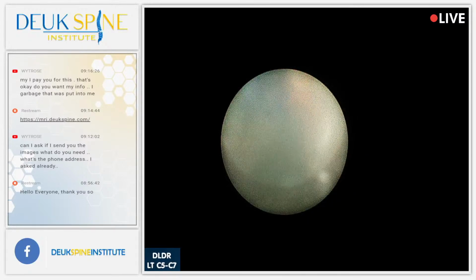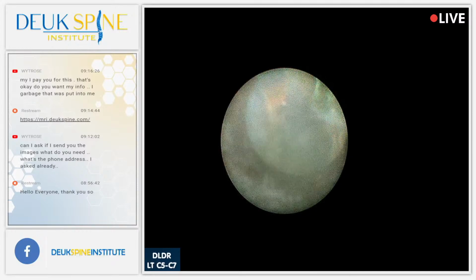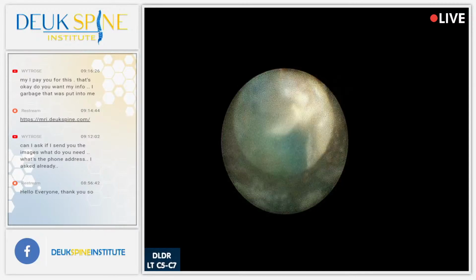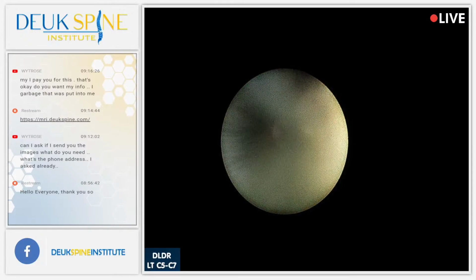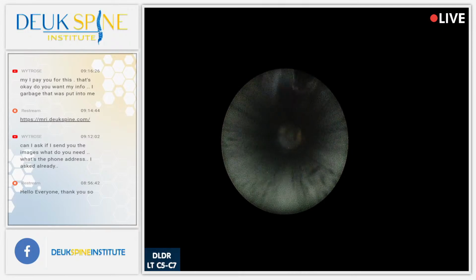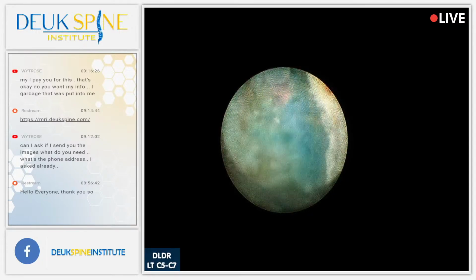I get this question a lot. Dr. Duke, can the laser remove bone spurs? Can you remove bone spurs? There's another herniation right there. So the answer is yes. The laser can easily remove bone spurs. But people say to me, when you do the surgery, you're going to take away all the bone spurs. The answer is no. If we take away all your bone spurs, then we're doing more than is needed to be done. Okay? And some bone spurs are okay. They don't need to be removed. It's only the ones that are pinching on the nerves that need to be removed. And it's only the disc that's pinching on the nerves that needs to be removed.